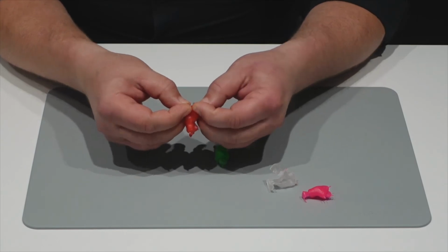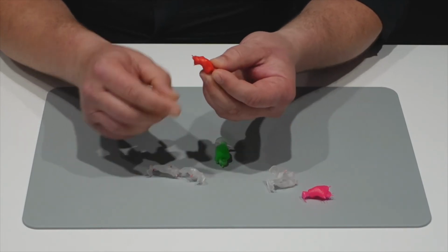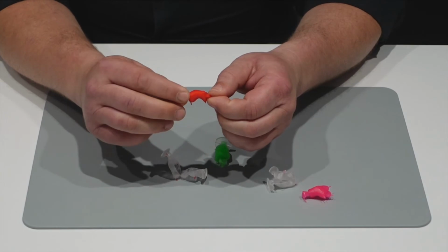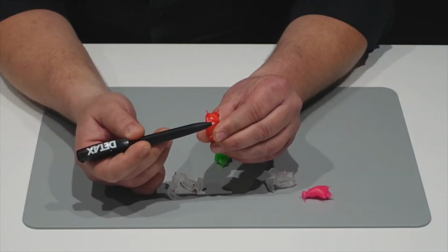I will show you once more again how easy it is to open. So if you don't talk so much in the meantime, it is much faster. You can see this is the result later. There are no areas with air. There's also, I hope you can see it in the camera, the engraving here. In this case, it is DETAX.